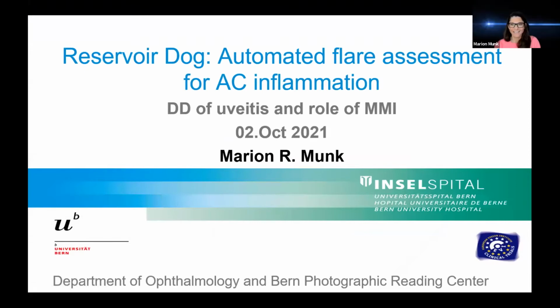Thank you, perfect. So now you've already heard Alessandro talking about the possibilities of imaging by quantifying anterior chamber cells and inflammation in the eye. I will touch a little bit on the automated assessment of flare for AC inflammation.